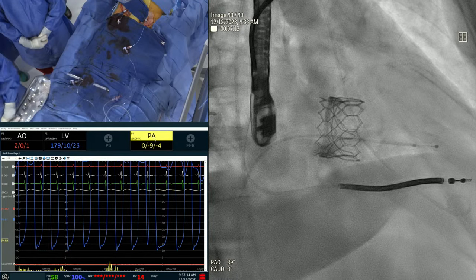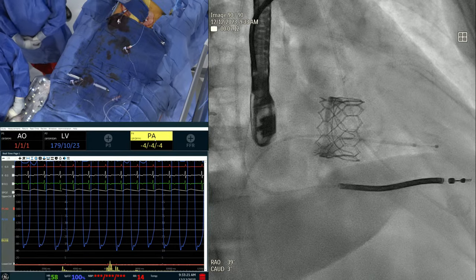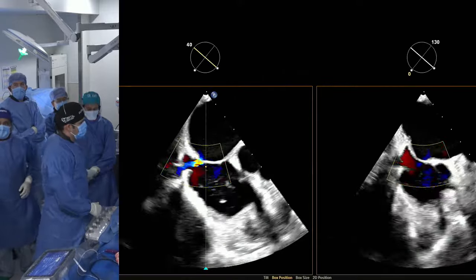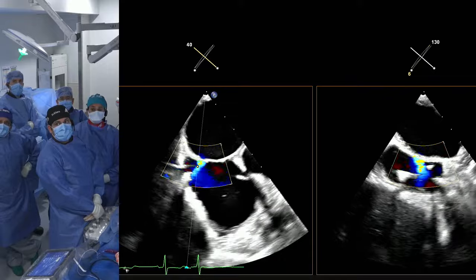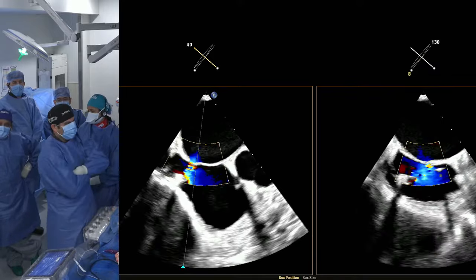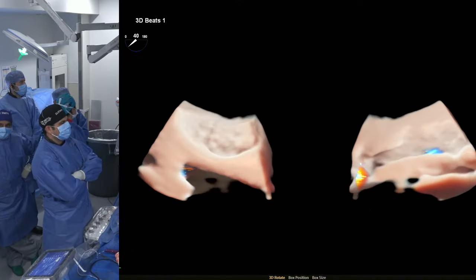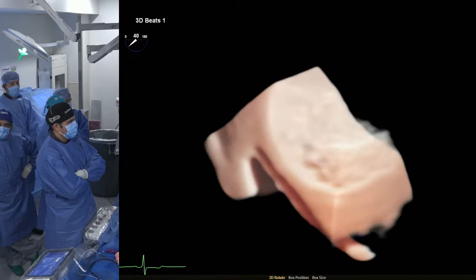Okay. Maybe we could see it left to right only a little bit. Show the echo again for that. For the septum. Do they want to see the ASD left to right? Yeah, we can measure here. Looks like 1.6 to 1. Eyeball QP:QS. Okay, tell us the echo QP:QS. We'll take a few measurements. Yeah, you can see it.